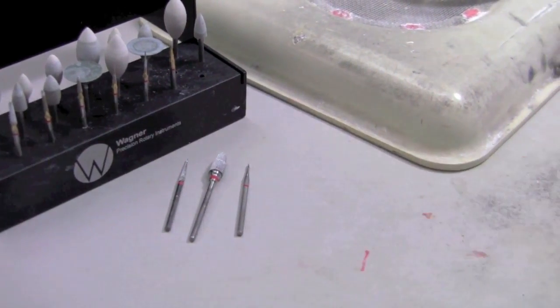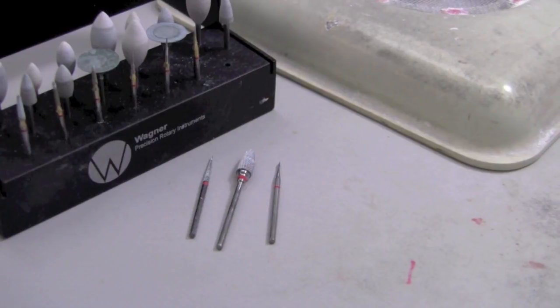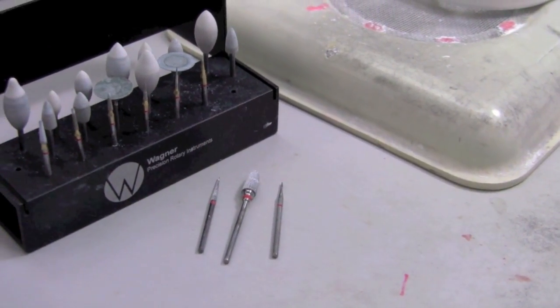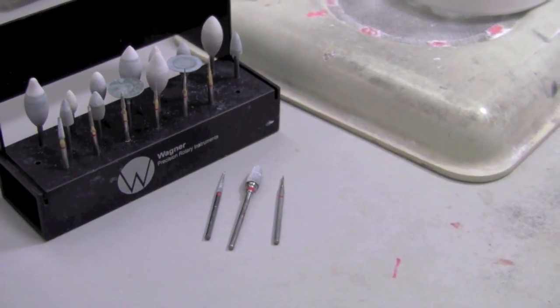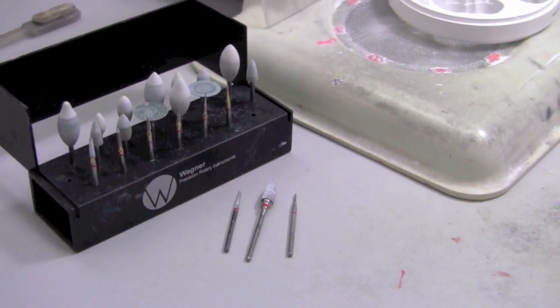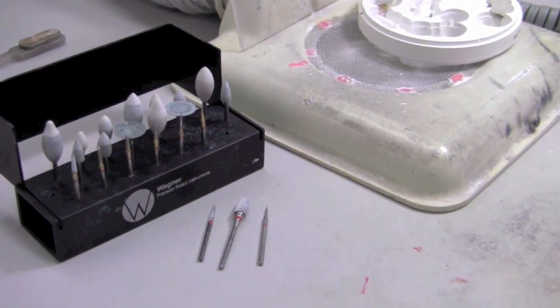The bigger carbide here I like for grinding off the sprues because it's very smooth and fast. And then this little tiny pointy thing, and you'll see it in action, I use to enhance occlusal morphology on posteriors to deepen the pits and fissures and make it look a little more natural.